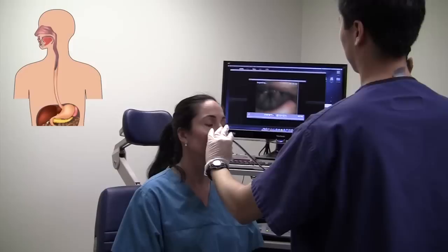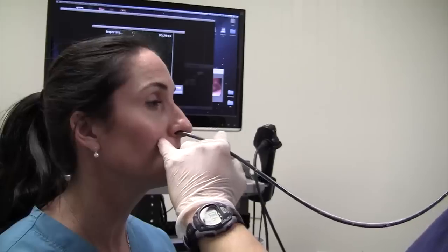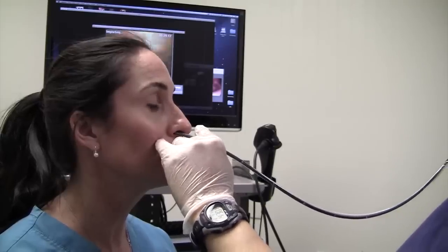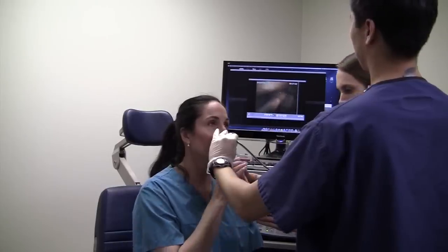Here we can see the voice box. At this point, the patient is instructed to swallow water a few times and the scope is then passed into the esophagus.